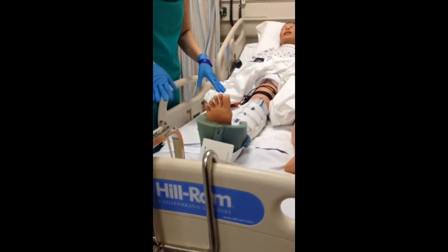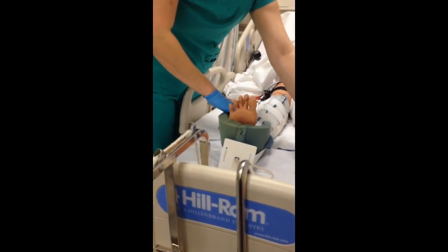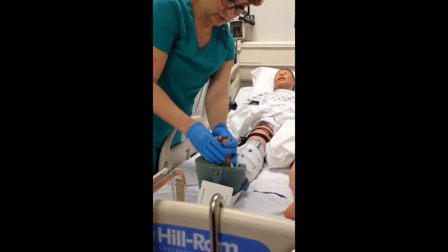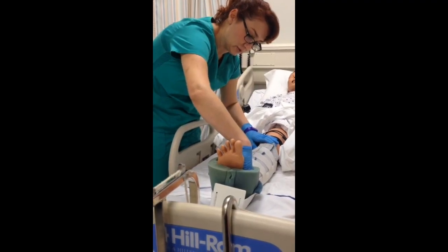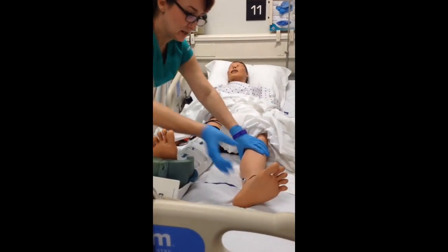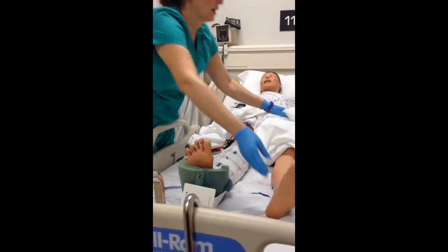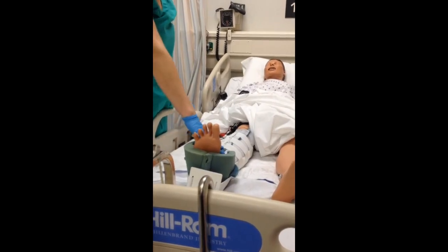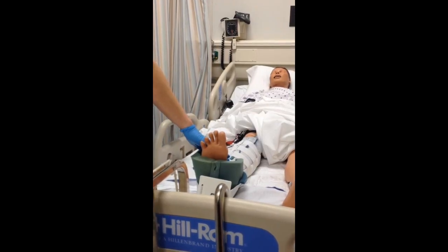Then we're going to assess our six P's again to make sure the straps aren't too tight. Pulses — okay. Wiggle your toes for me please. Capillary refill — the toes are warm, not cool or anything, so that's a good sign. Pulses are good. She can move. Now we're going to check range of motion in the non-affected side — can you move your ankle? Bend your knees. Any numbness or tingling in your toes? No. No numbness or tingling — that's good.